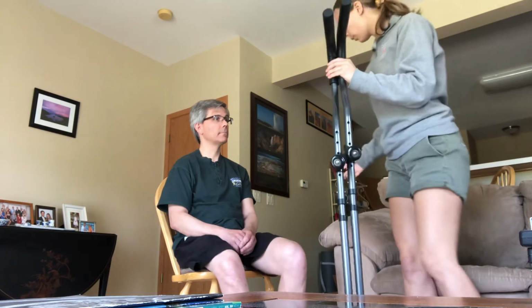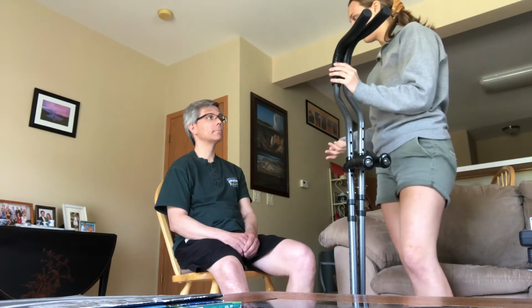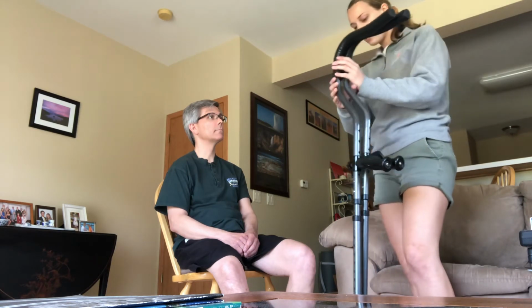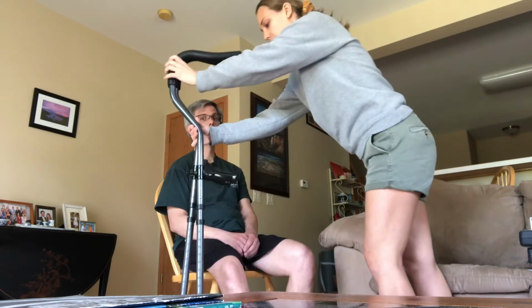Okay, so today what we're going to be doing is we're going to be getting up in a second from the chair, which I'll instruct you how to do really quick with the crutches. And then we're going to be walking this way and walking back, so I'll be moving the chair for you. But first things first, we're going to put it on your right side, since that's your affected side.